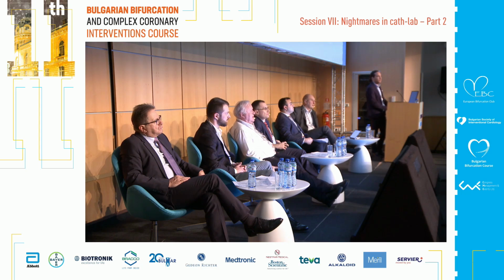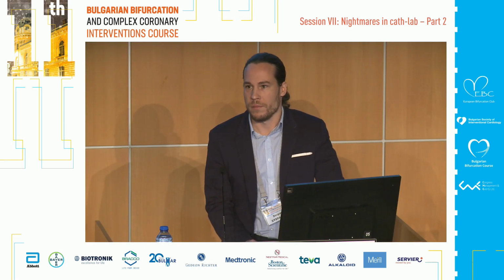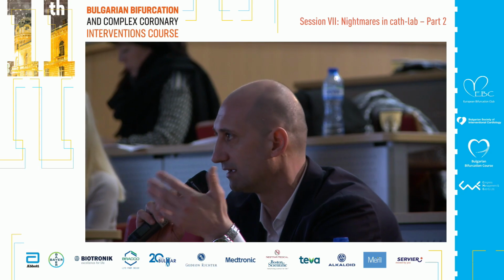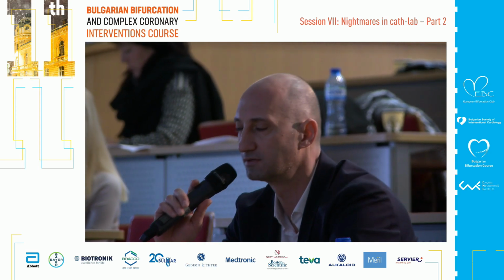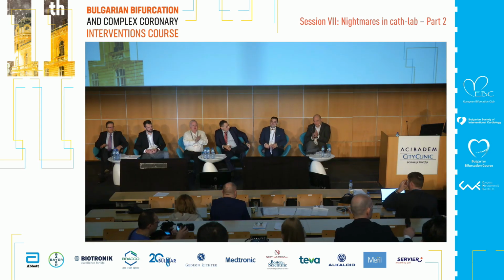Sashko? A great case, a great solution to a huge problem. Probably the problem is the endothelial dysfunction of all the walls of the arteries, aorta, etc. But this is the PFO ASD occluder that you used, or what was it? This is vascular. Okay, because if it was an ASD occluder, they are meant to endothelize. And there is a risk for occlusion of the SFA. Yes, but that's why we use it. Okay, thank you so much. Thank you. Superb.